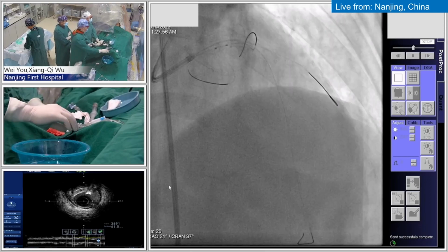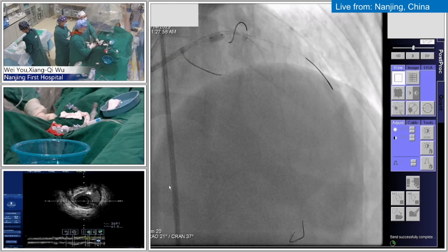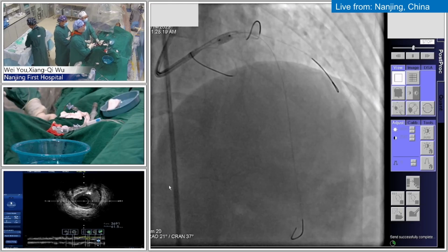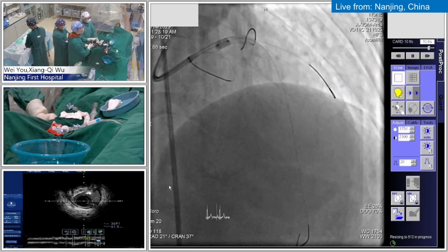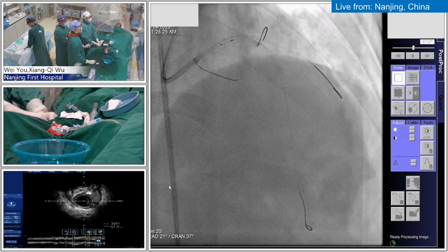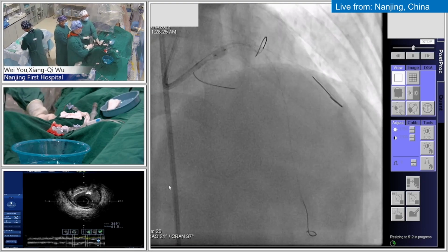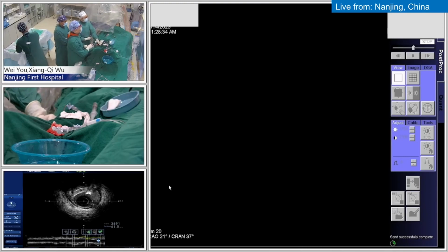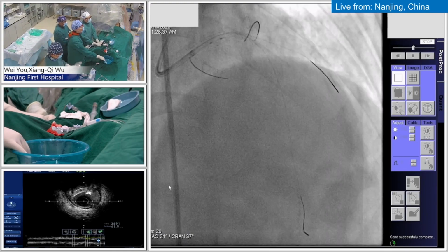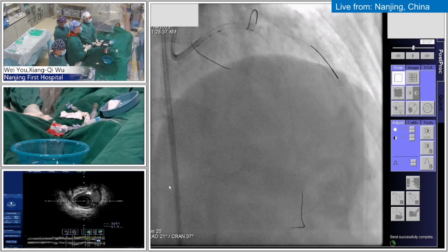And what about MicroPort? Are they into structural heart also? And right. Is this Dr. Chen's short balloon? Okay. Yes, Professor Chen's short balloon. Okay. Yeah, just designed for POT, the balloon, huh? Yeah, you're right. With no shoulder. Okay. Okay. Done. And with the length, it's very suitable for the POT.